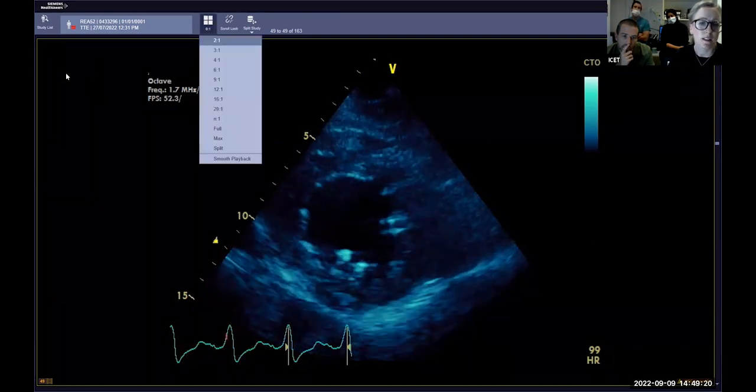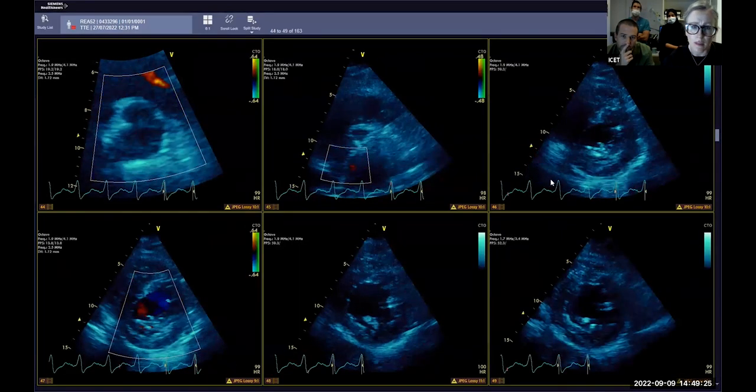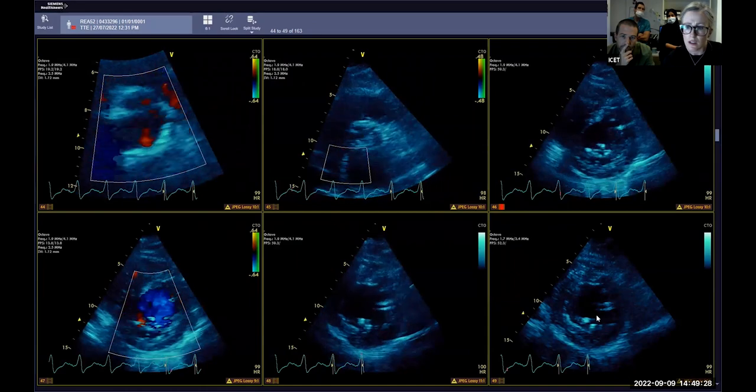Coming back now, let's interrogate her aortic valve.